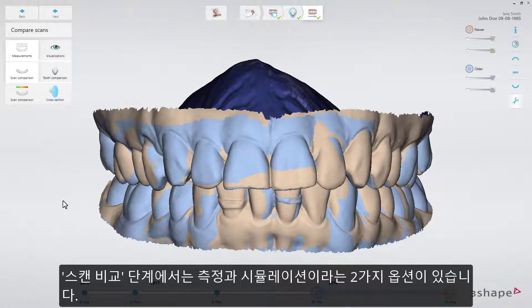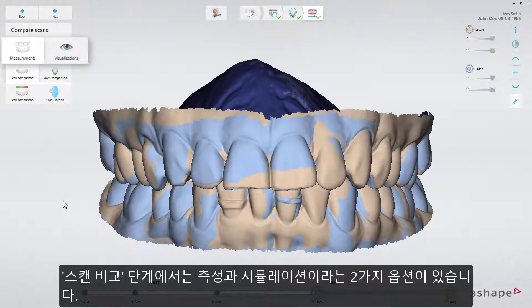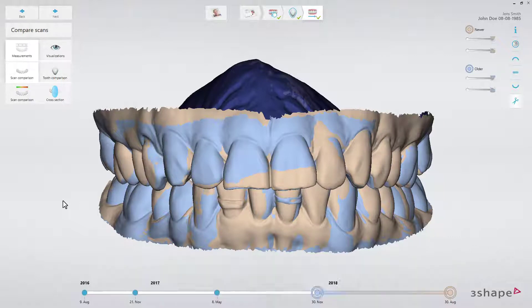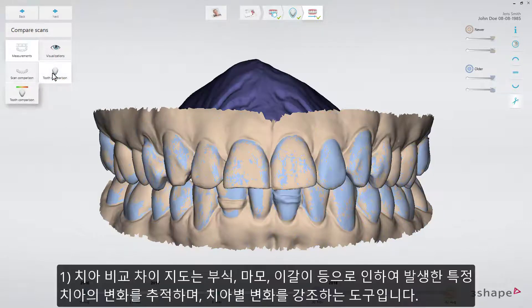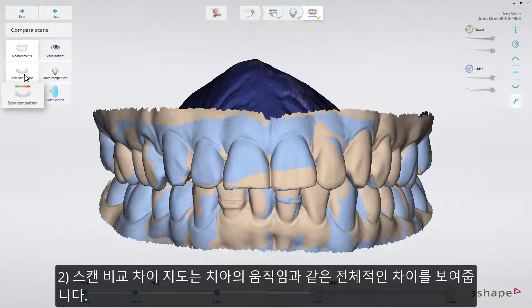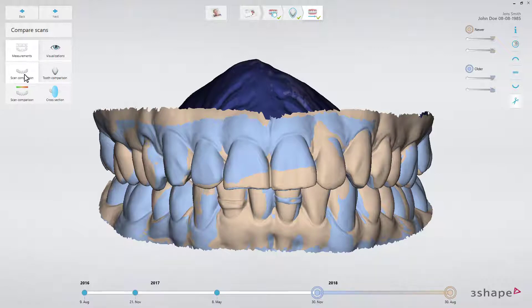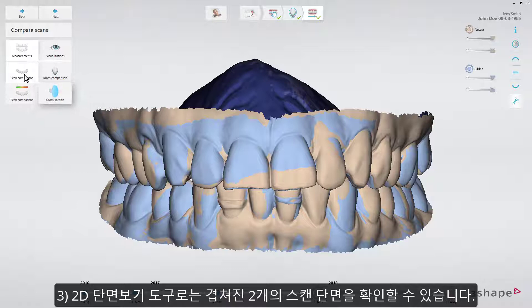In the Compare Scan step, there are two options: Measurement and Simulation. In Measurements, there are three tools that can be used to inspect and measure. Tooth Comparison Difference Map highlights tooth-specific changes, which can be used for tracking changes caused by erosion, abrasion, attrition, chipping, and so forth. Scan Comparison Difference Map shows global differences such as the movement of teeth. The 2D Cross-Section Tool shows a cross-section of two overlaid scans.